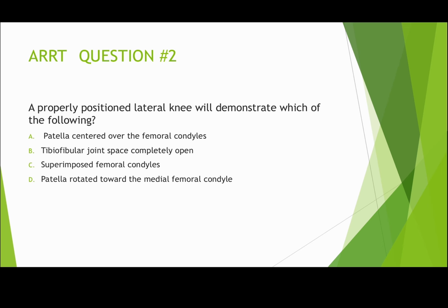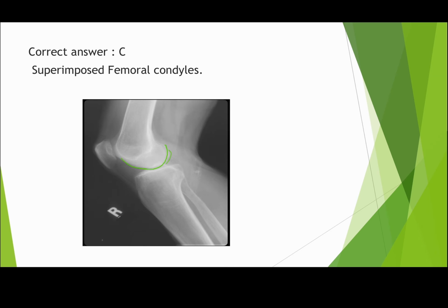Question number 2. A properly positioned lateral knee will demonstrate which of the following. Correct answer is C. Superimposed femoral condyles.